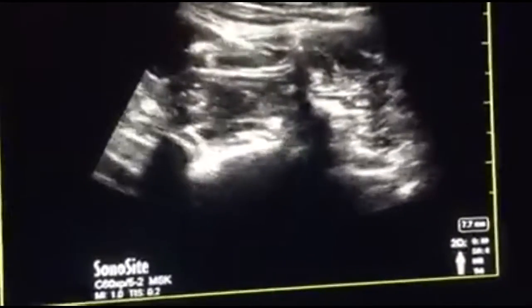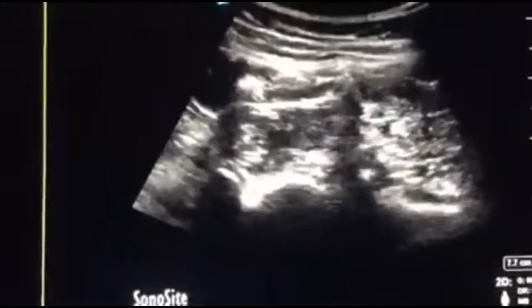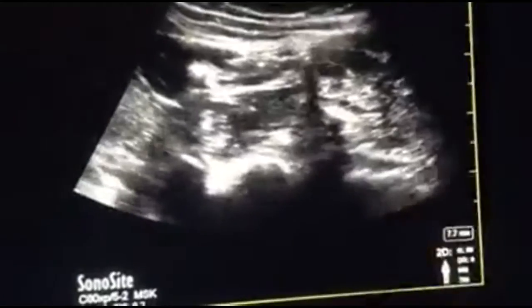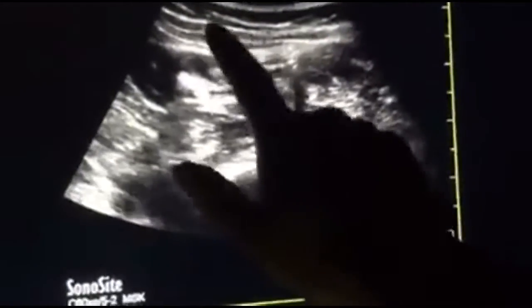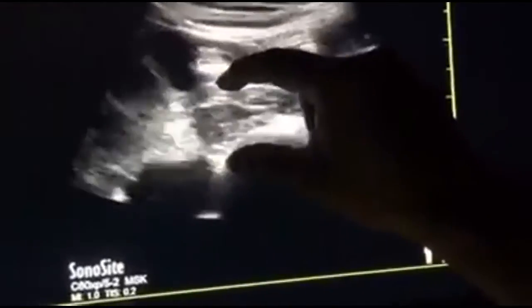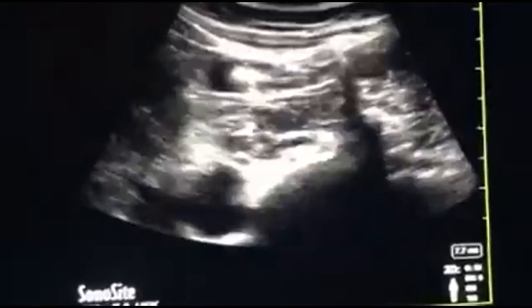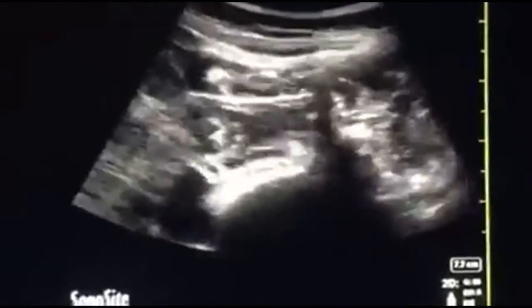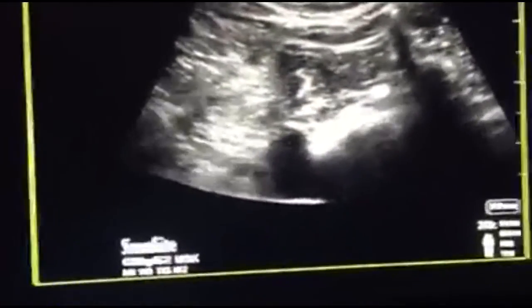So probably one of the roots started getting visualized, may or may not be, but this is the QL1, you can say, the anterior most part of the quadratus lumborum muscle. So this is quadratus lumborum, transverse process, vertebral body, in between that is the psoas, and this is all about the quadratus lumborum block.